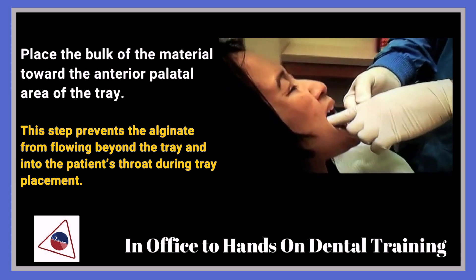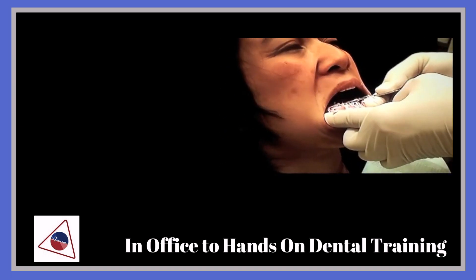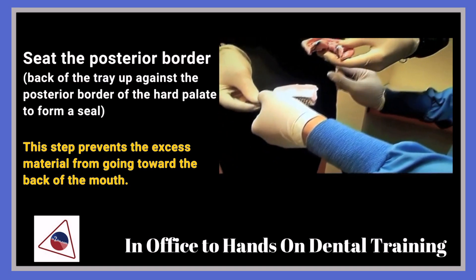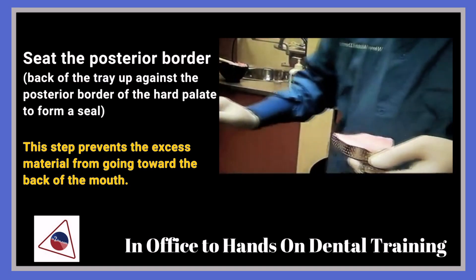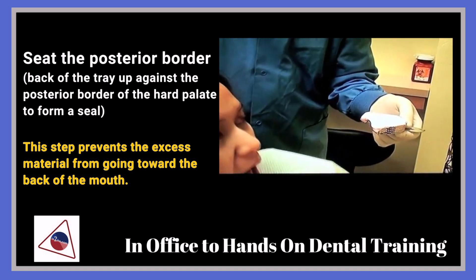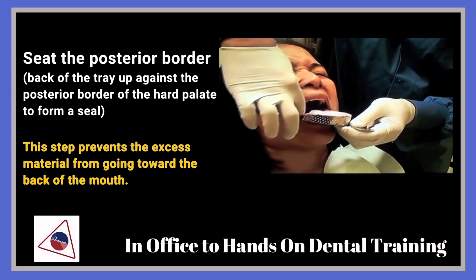The way you take out the bottom one is you start from the back first, then pull it up. When you put the top tray in, you start on one side and relax the lip.